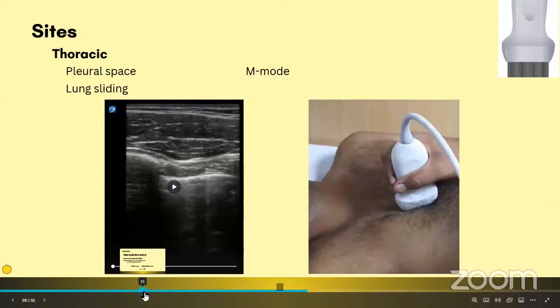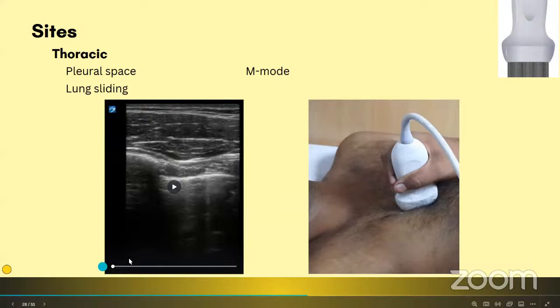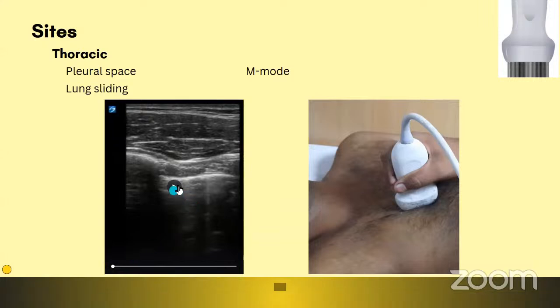As I discussed earlier in the probe slide, linear probe produces streamlined ultrasound pulses parallel to each other, which are of higher frequencies, more than 5 megahertz. Since they're higher frequency, there is higher resolution with reduced penetration. So they are complementary to each other, right? So now I'm going to get much clearer and better images here. However, it is only limited to the superficial surface.